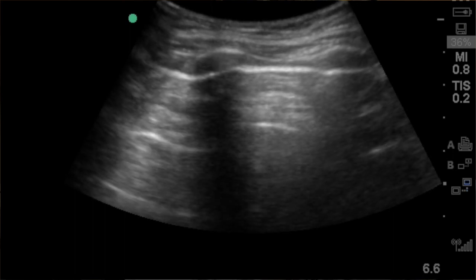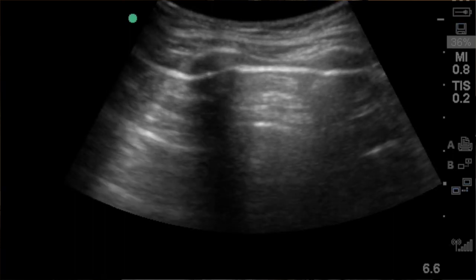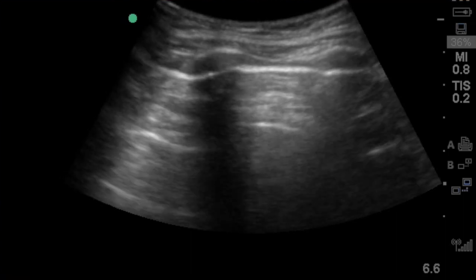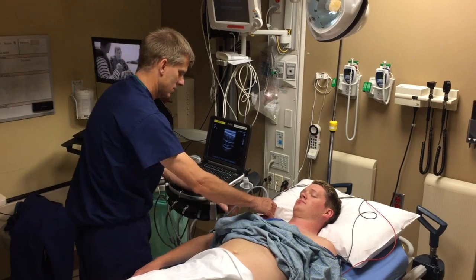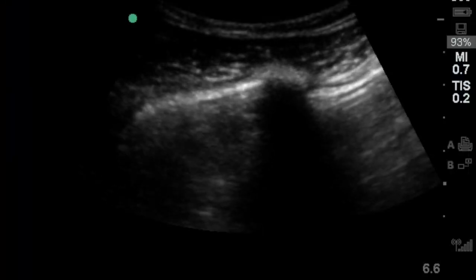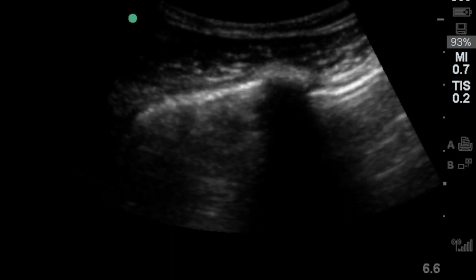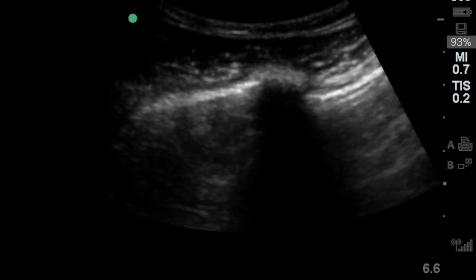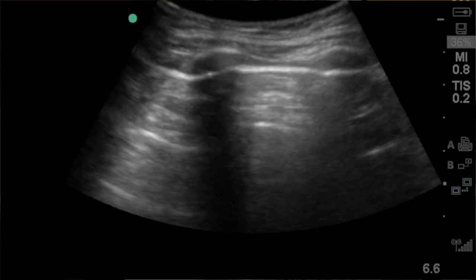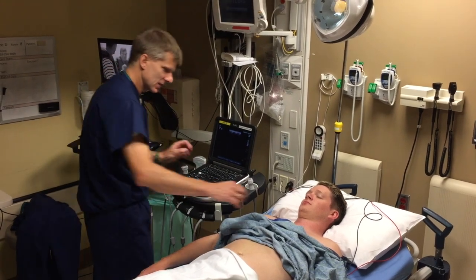P — Pneumothorax. Let's take a look here. Oh yeah — no lung sliding at all on that side. Looking good over there on the other side. In the setting of hypotension, that almost certainly means tension pneumo. Let's prep for a chest tube and get him fixed up.